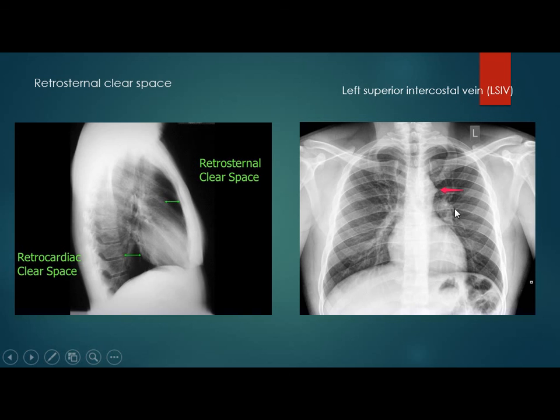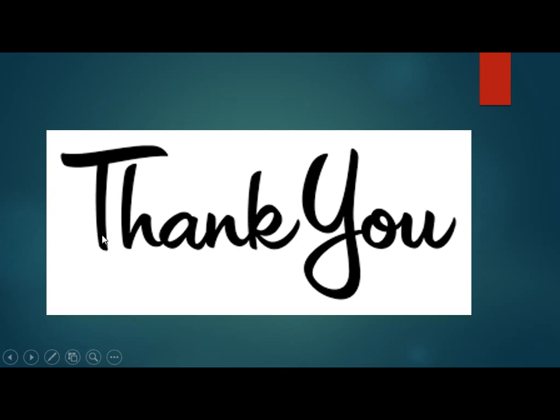There are two clear spaces: the retrosternal clear space and retrocardiac space. Obliteration of the retrosternal space may indicate a mass; if it increases, it may indicate emphysema. A normal variant — the left superior intercostal vein — when it contacts the aorta, gives the nipple sign and should not be mistaken for pathology. And that's all — thank you.